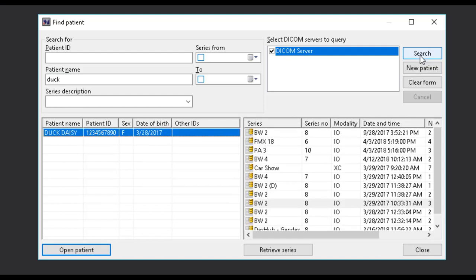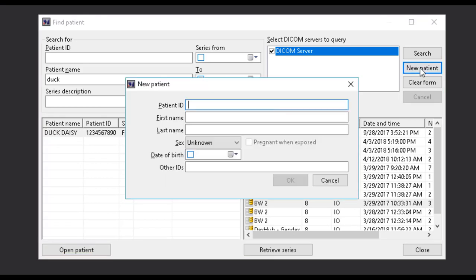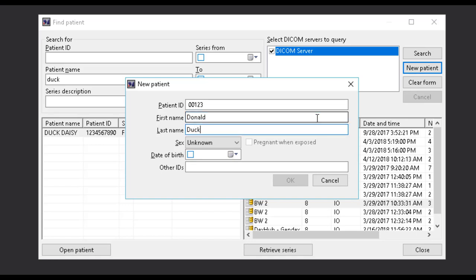If, after searching, the patient does not already exist, you can create a new patient record directly from the search window. Select New Patient and input the patient ID, first name, last name, gender, and date of birth to create the new record.